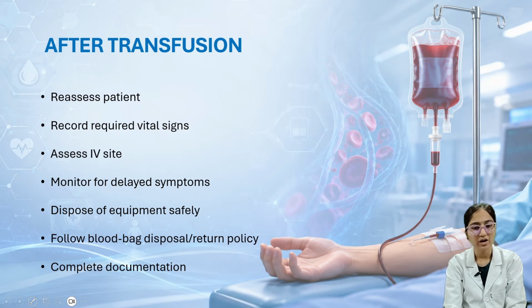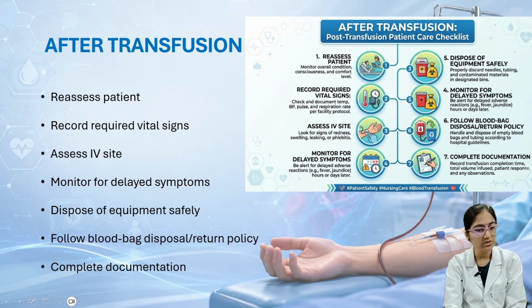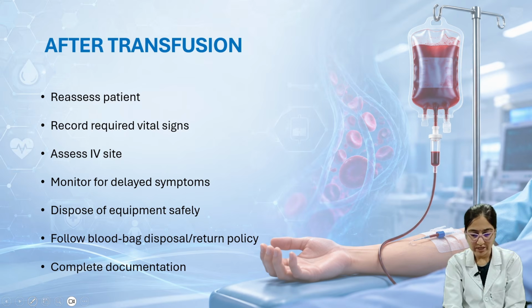Next, after transfusion. After blood transfusion, reassess patient. We need to reassess. Assess the patient and then record required vital signs. Assess IV site and then monitor for delayed symptoms and then dispose of equipment safely and then follow blood bag disposal or return policy and then complete documentation.